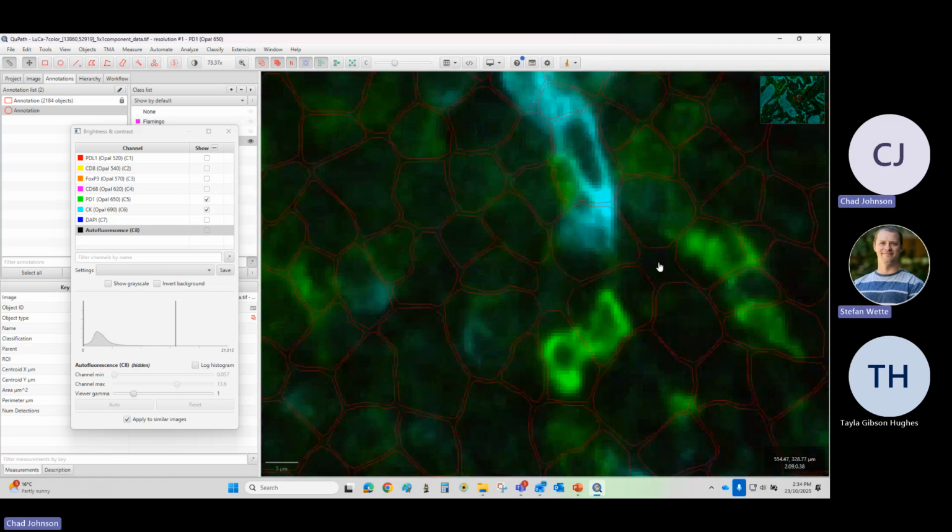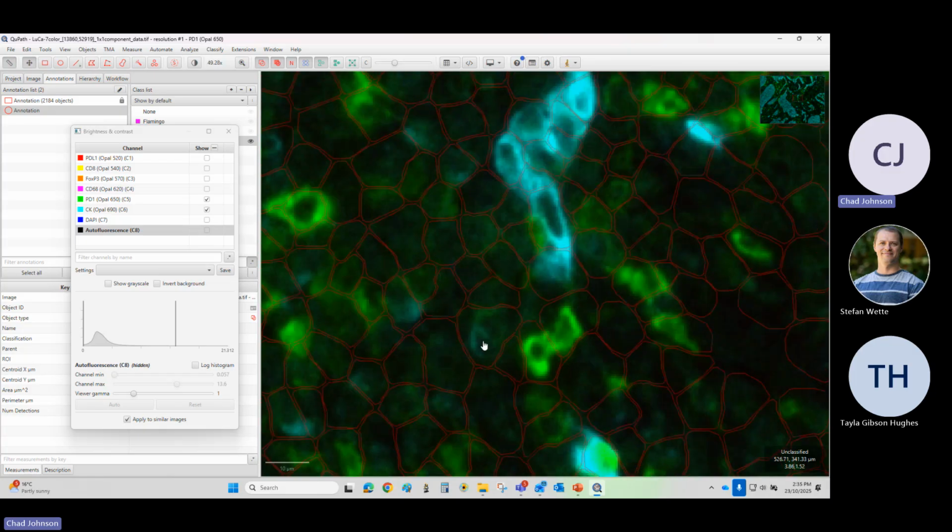But yeah, you'd have to be careful with that because you're juggling more balls than normal. Yeah, it might take more training. Yeah, it'd be just as much training. It'd just be you paying attention. That's the main thing. It's just making sure that you're actually choosing green and blue, and what is positive, versus something that's green and blue but is probably negative. It's probably autofluorescence, etc. So yeah, you could definitely do it with as many channels as you wanted.